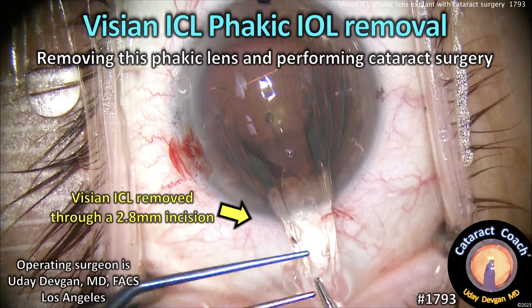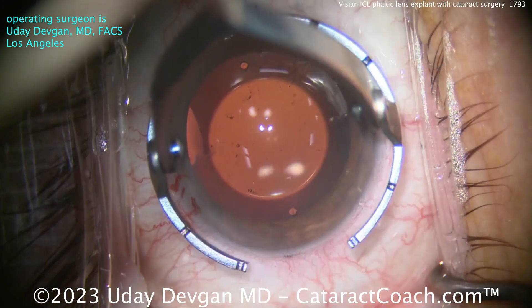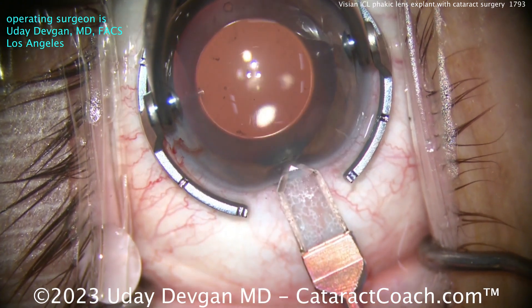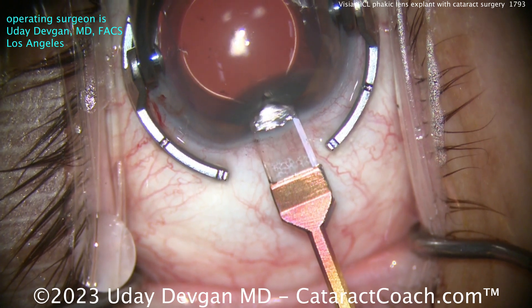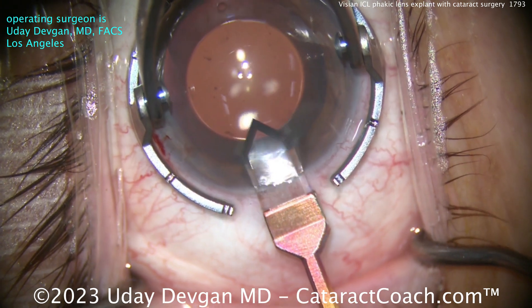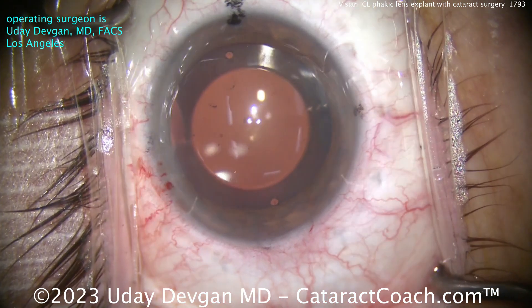Removing this phagic lens and doing cataract surgery. The patient had ICL placement done by me about 20 years ago for treatment of minus 12 diopters of myopia. She did very well for about 20 years, and now she's since developed a little bit of a cataract change, obviously presbyopia now that she's about age 50, and of course it's time to do surgery here.